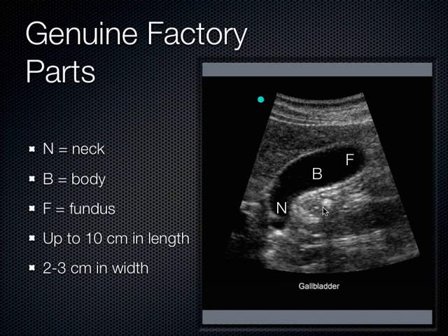Air, as I mentioned, can sometimes cast a dark shadow or a bright shadow. It's variable. And so, doesn't this look almost like a stone with a shadow behind it? Yes. Okay, now knowing that, think about how sound comes out of the probe. You think about sound being microscopically thin, but actually the sound that comes out of the probe has some thickness. In this example, the thickness of my fingers is maybe 1 centimeter thick. Sound is about 1.5 millimeters thick.